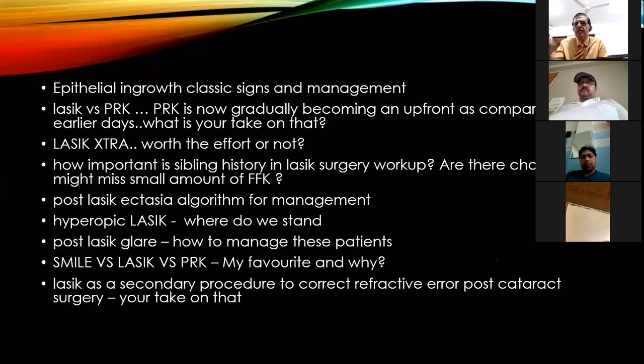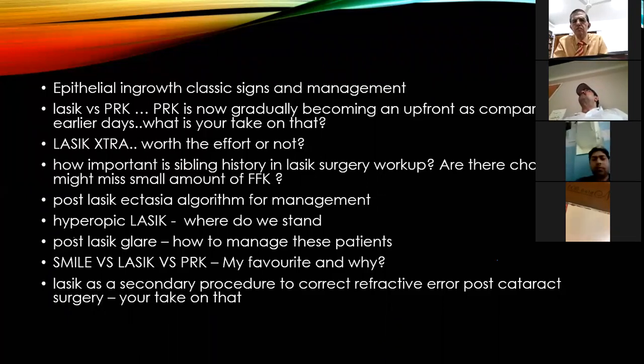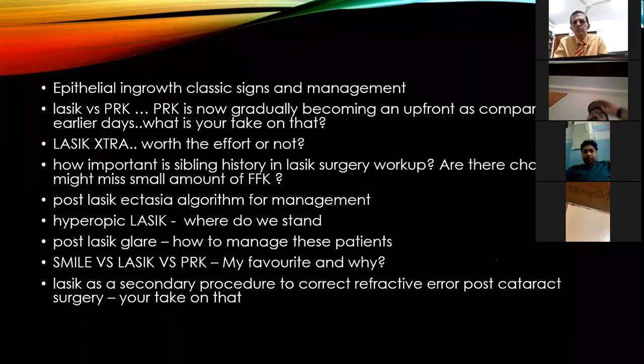In days gone by, in the days before the Topolink, I had a special way of intentionally decentering the laser to compensate for that. It was sort of a guesstimate way of doing things, but you wouldn't even dream of doing it today.